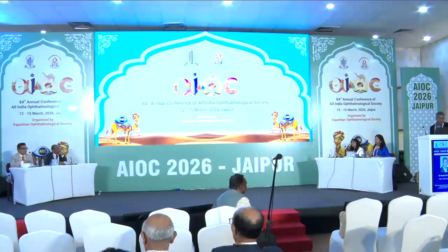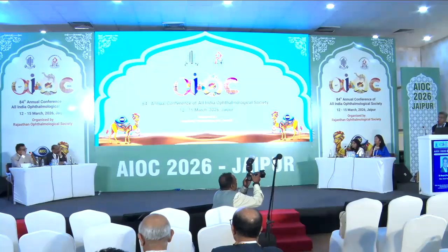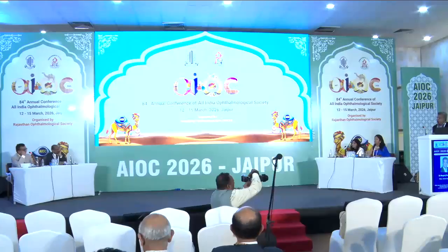Thank you. Usually it is done while cataract surgery is being done. Is it so, or can it be done standalone? You can do it standalone also. Can it be a primary glaucoma surgery? But mostly, most of our procedures have been combined with cataract.